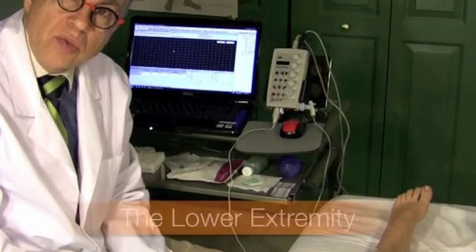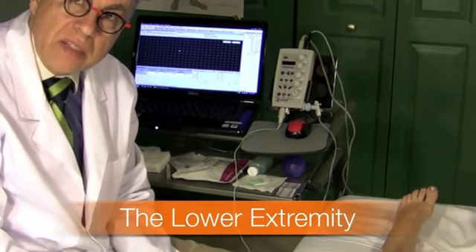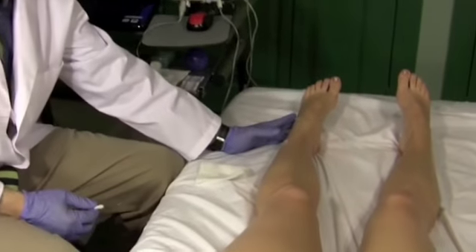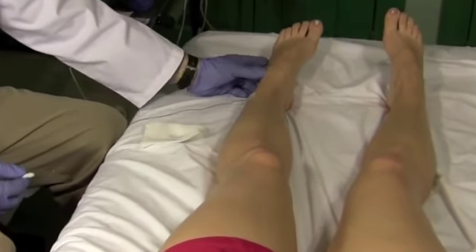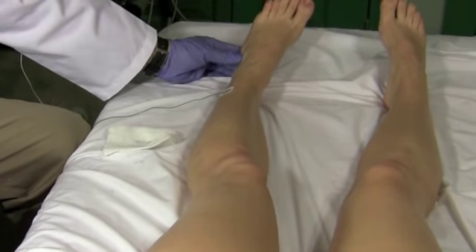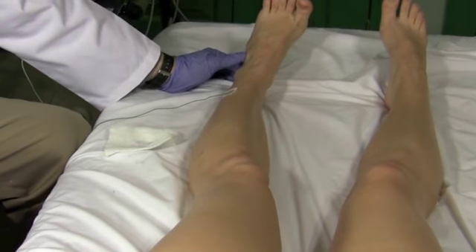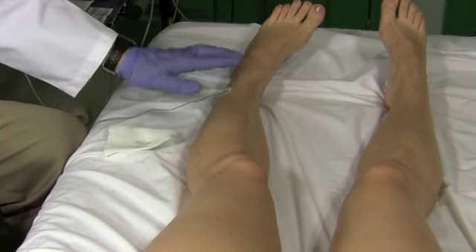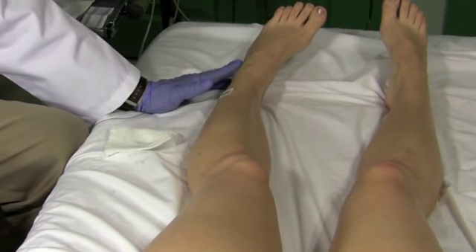So now we're going to do the lower extremity needle exam. In the lower extremity, we do several muscles. First is the extensor digitorum brevis muscle, which is this muscle here that when you point your toes towards your nose, it bumps up. Relax your toes. Point them up again. See the muscle pumping up? Okay, relax. That's a peroneal innervated muscle, L5S1.